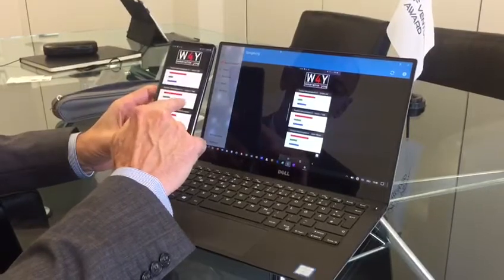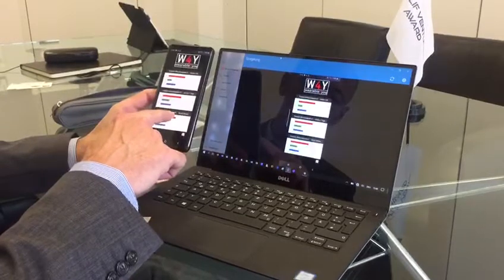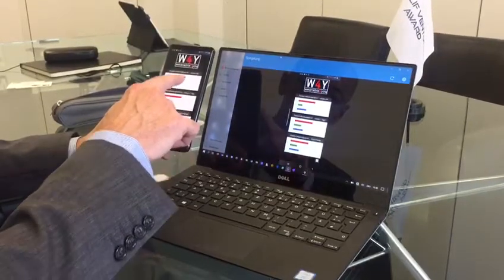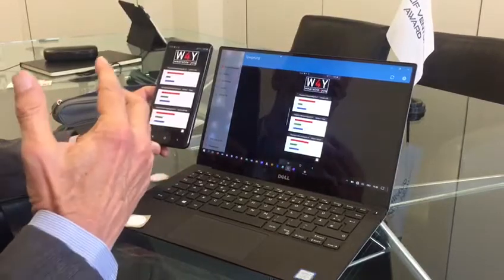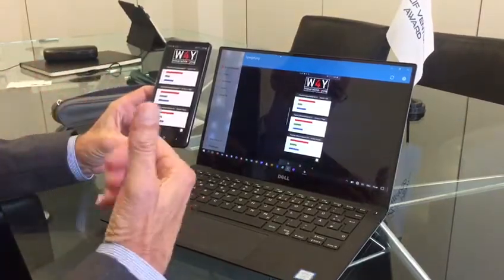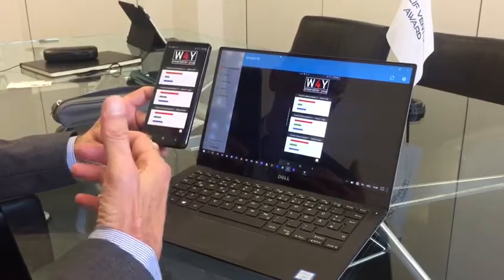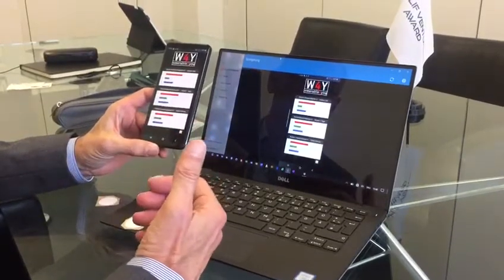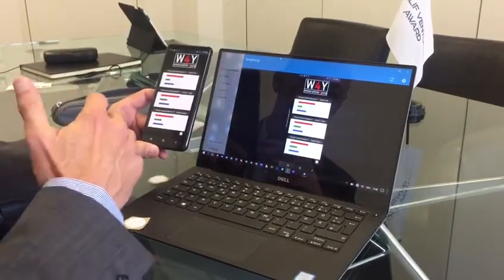If you look at 7 days, you can actually see a trend. Most of the time, this device is needed in room number 3. So based on that, if somebody is looking for it, maybe it's a bit hectic, he will remember, most of the time it's in room number 3, so you can go there.